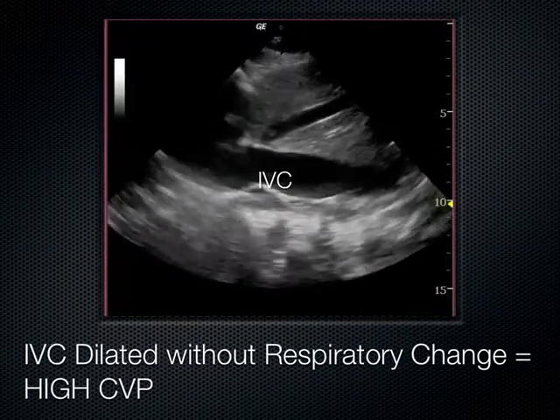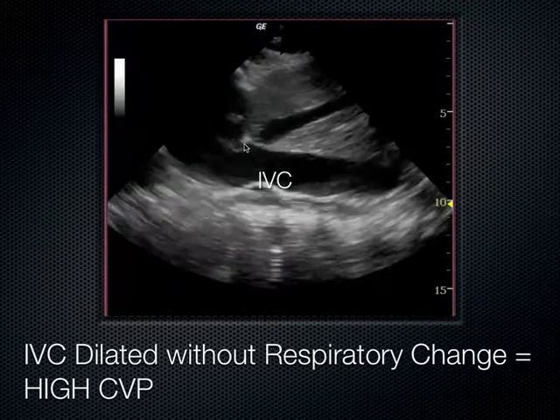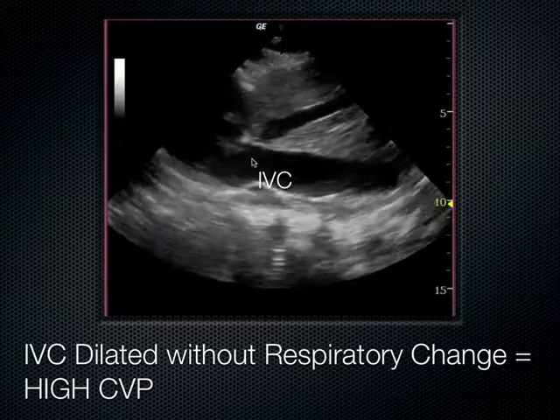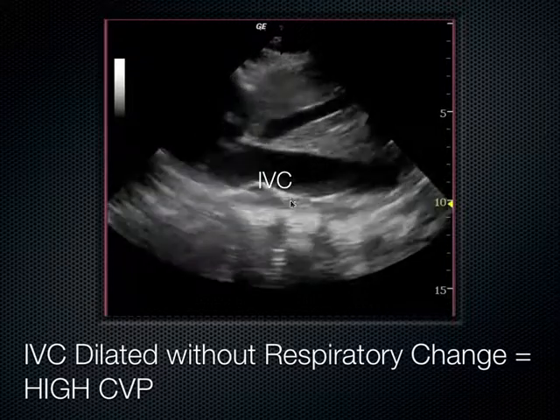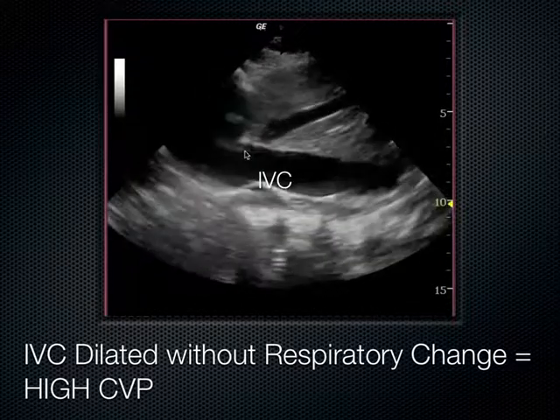Again, here's one that's plethoric, it's very large, doesn't change with respiration. In this case, though, I want to point out the hepatic vein. Hepatic vein drains into IVC. The location in which to really focus on the IVC's diameter change is about 2 centimeters distal to where the hepatic vein drains in.